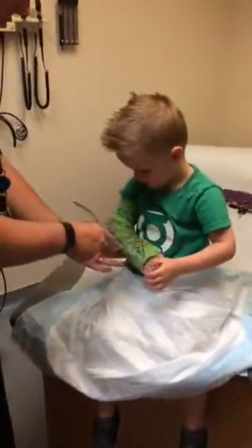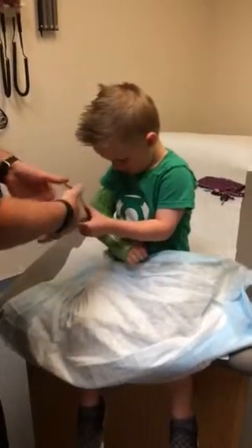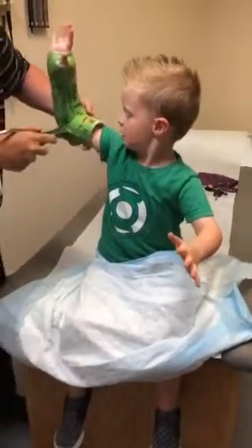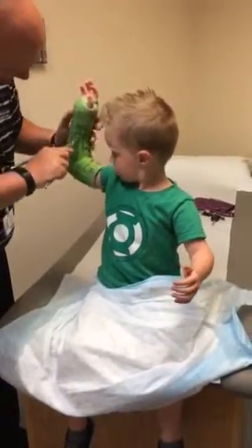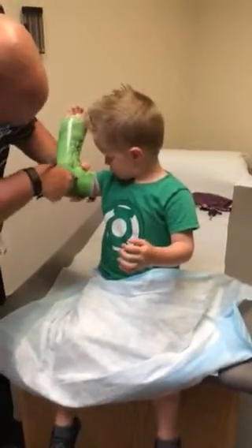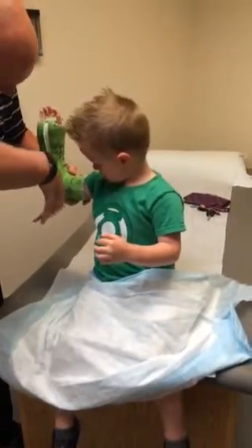On three, we're going to squeeze. Did you see it break up there? Now I want you to raise your arm up in the air — touch the sky with your cast. Let's do this part, we got this part ready. My God, got the cut. Just got to get this one little part here. I think I can crack it. There we go, bud.